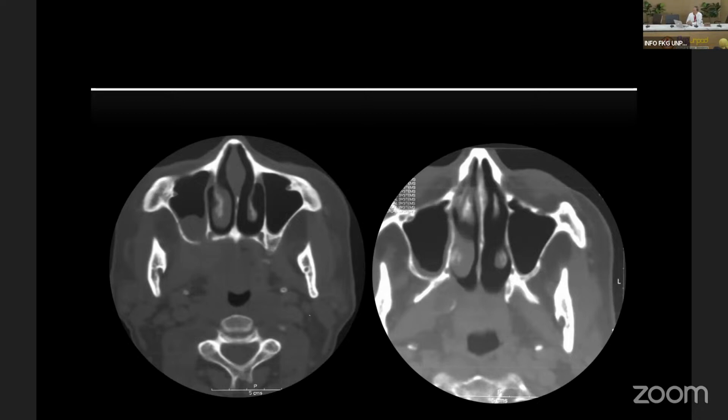But mucosal thickening, like my radiology residents say, we see all the time. If you do implants, a lot of patients have mucosal thickening. But this patient is different.